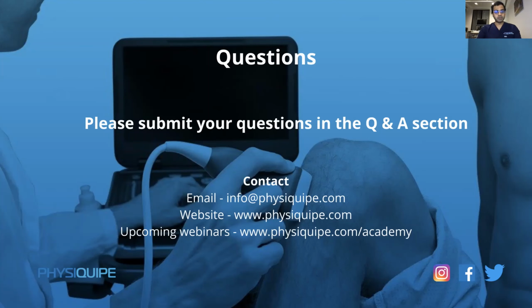So I tend to use both ultrasound and MRI for assessment of sportsman groin, unless one of them gives me the clearest indication altogether. And sometimes you can get dual pathology, so when you do the reports, the question falls back to the clinician that, look, we found this on the ultrasound and we found this on the MR. You might find 2 or 3 pathologies, and then we throw it back to the clinicians to re-examine and reassess to work out which is actually the most likely offending pathology. So, yeah. Thanks very much.